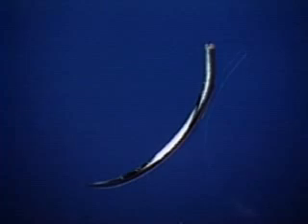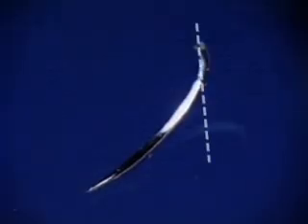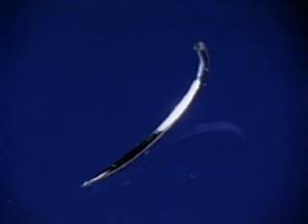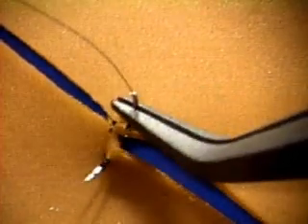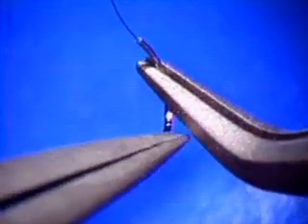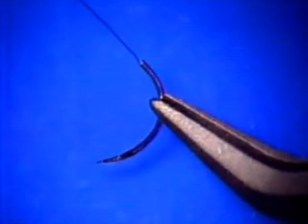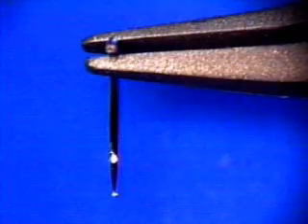Now the third and fourth points. Holding the needle squarely in both this axis and this axis is important because that's the only position in which it'll hold steady when you push it. If you have it tilted on its horizontal axis, when you push it, it'll capsize. If you have it rotated in its vertical axis, the same thing will happen. Hold it square in both planes, and it'll go where you want it to go.